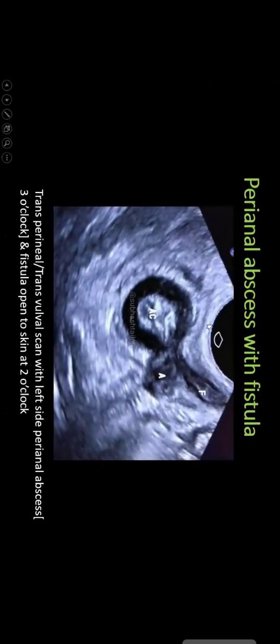Another case, there is an internal opening, there is an abscess at 3 o'clock position, crossing the external sphincter and internal sphincter. So transsphincteric abscess, ischioanal abscess. And there is a fistula tract in the perianal area at 2 o'clock position. So there is an abscess, there is a fistula, there is an internal opening, there is an external opening.